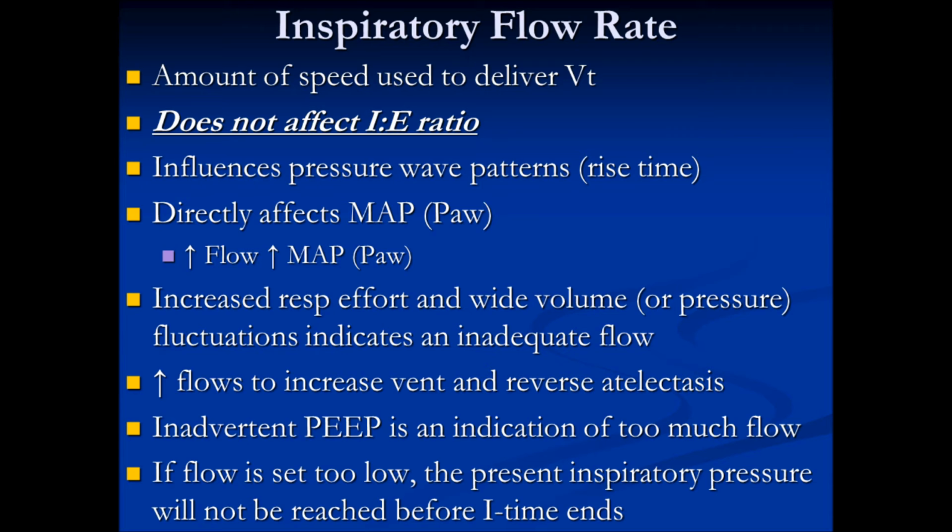If they seem air hungry, even neonates, if you increase that flow, they should go back to looking normal. You're not changing any of the settings that the doctor gave. You just increase that flow, and the patient will look more comfortable.